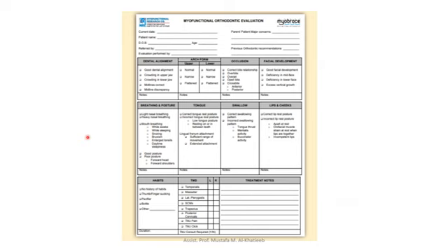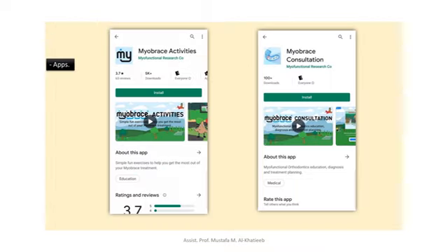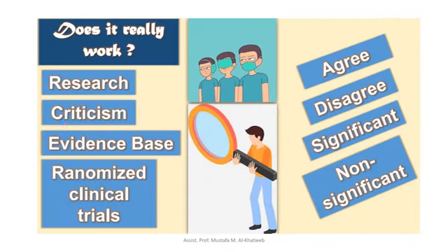Also, the Myobrace treatment system should involve a special case sheet. There are many applications in iOS or Android system for the activities, but we demonstrated briefly in a previous slide. Does it really work?